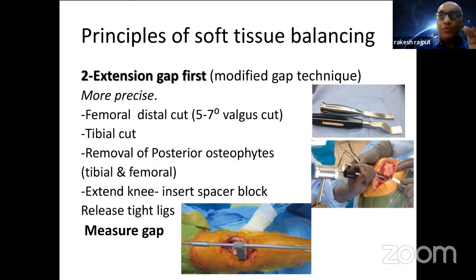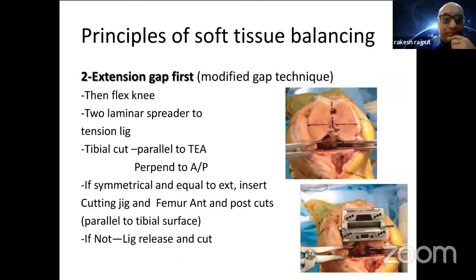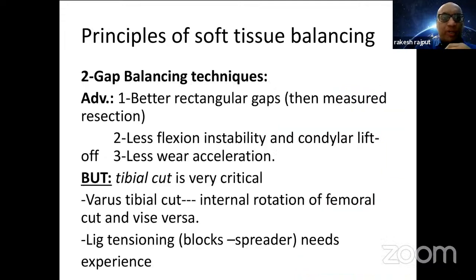So that is why many people prefer to do the flexion gap first and then come on to the extension gap. So that's about what you want at the end. And I think that's what it is. So we've discussed two gap balancing techniques, but in both of them, the tibial cut is very, very important.